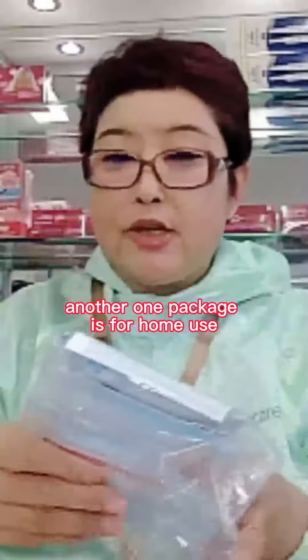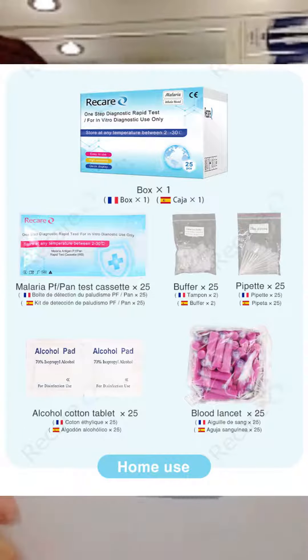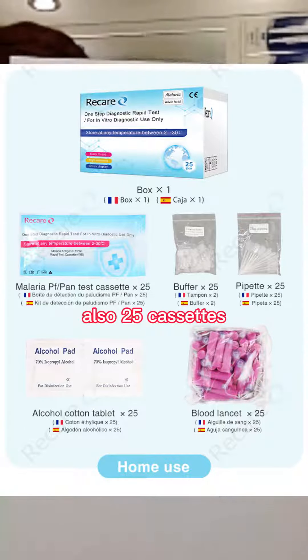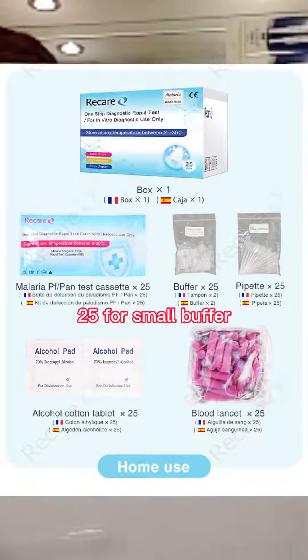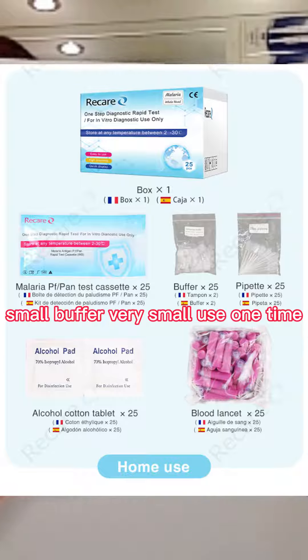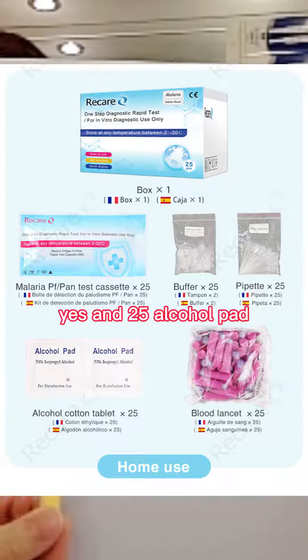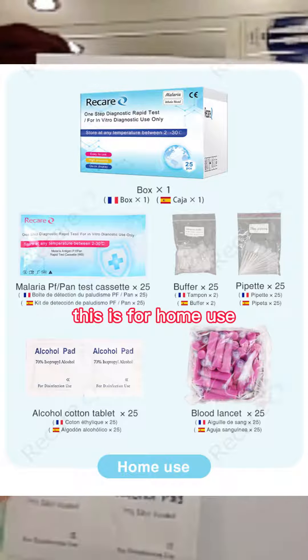Another package is for home use. Also 25 cassettes, 25 droppers, 25 small buffers — very small, used one time — 25 lancettes, and 25 ecopore pads. This is for home use.